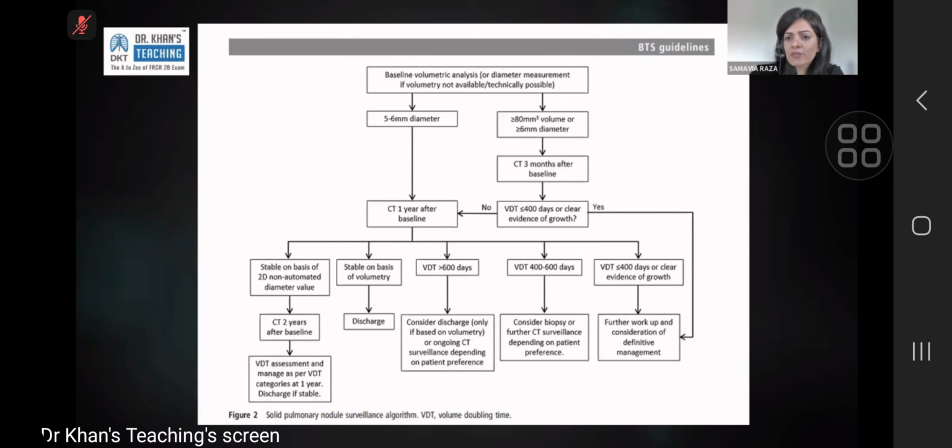Okay. Let's pause on the questions so I can actually answer them. How accurate is CT in measuring nodules? There's been quite some work done on it recently, saying that based on the degree of inspiration or expiration, there can be subtle change in the size of a lung nodule on a CT if the nodule is at the extreme lung base. This is complex and research. For the purpose of a general radiologist, for the purpose of a registrar, the CT is extremely accurate in measuring a nodule, assuming that the CT quality is good, as in the patient isn't breathing all over the place.